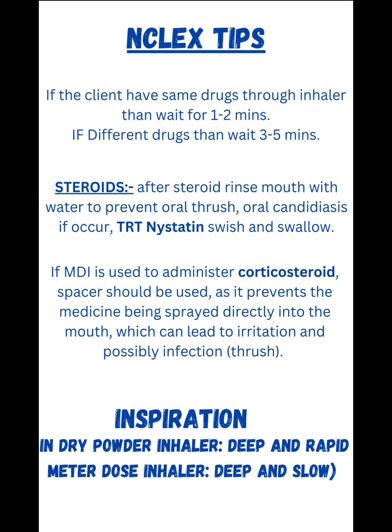For the inspiration pattern, in the dry powder inhaler, always remember we ask the client to inhale deeply and rapidly. And for the metered dose inhaler, we ask the client to inhale deeply and slowly. Okay, that's it for the metered dose inhaler.